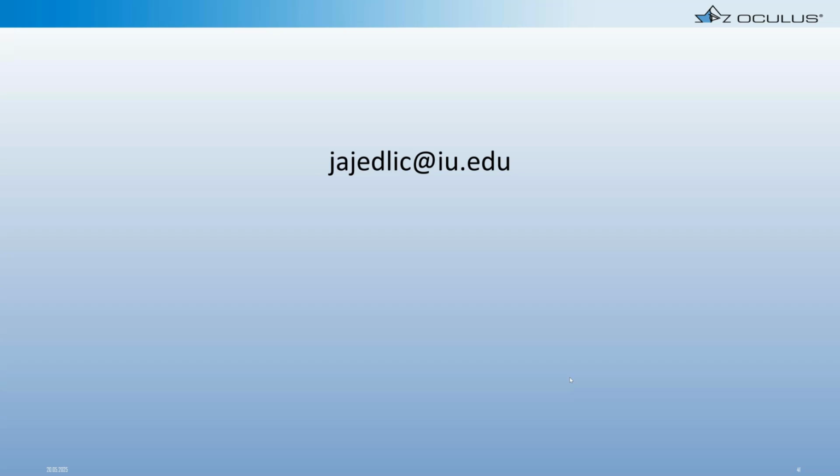And assuming this is a child. If this is an adult who wants Ortho-K, then obviously I'm not necessarily talking about myopia management, but we're still talking about what your options are for vision correction. Is it soft lenses? Is it Ortho-K, et cetera? And if we make a decision that we want to proceed with Ortho-K, then we're going to double check the refraction at that visit.